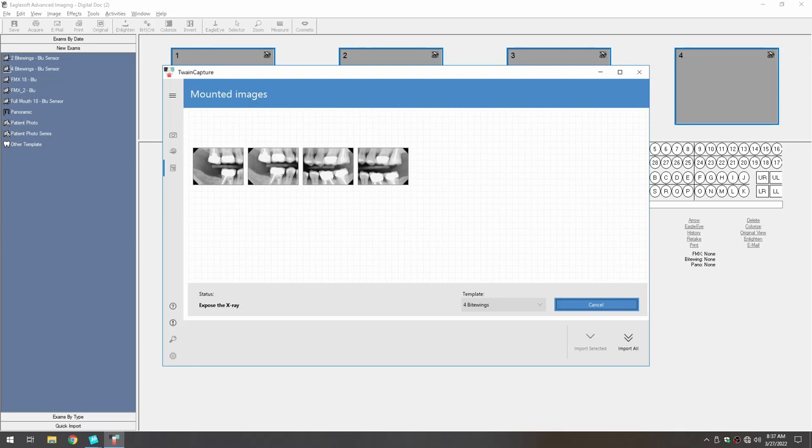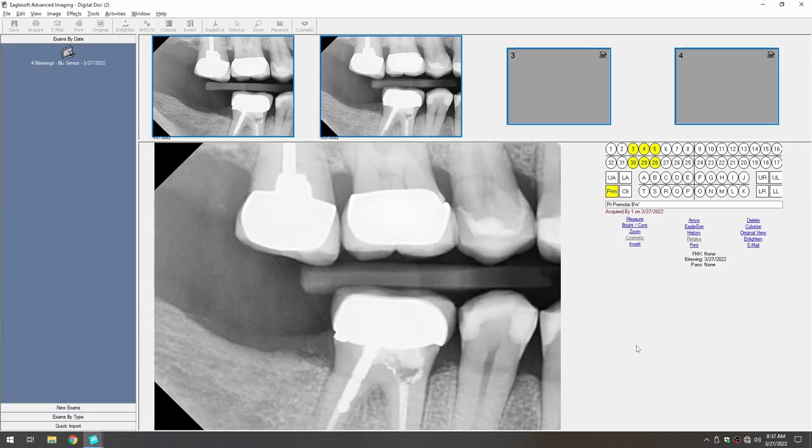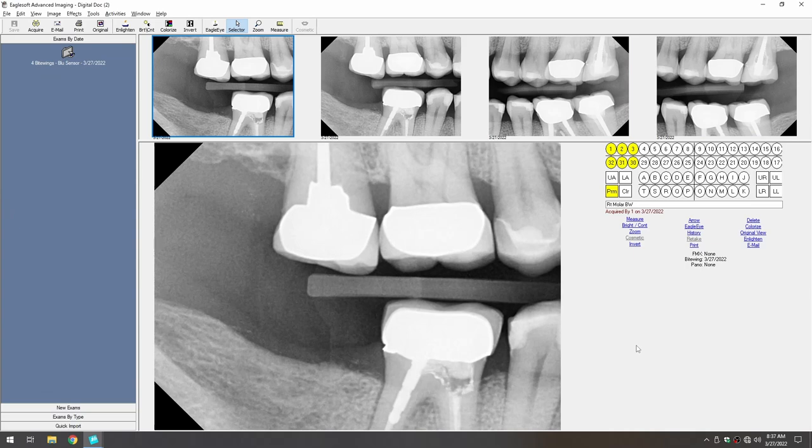Once acquisition is complete, we'll click on the Import All button. This will transfer the images from the driver to EagleSoft in the correct order and the correct orientation.